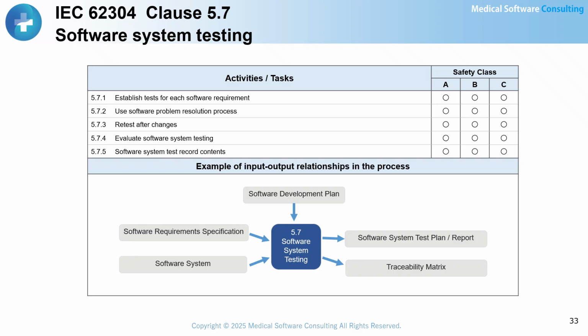for the medical device software have been correctly implemented. In other words, system testing demonstrates that the defined functions are present and that the software, as built, meets both the functional and performance requirements. Software system testing may be carried out in a simulation environment, on the actual target hardware, or on the complete medical device. However, when testing is not performed on the final product, we must carefully consider the differences.